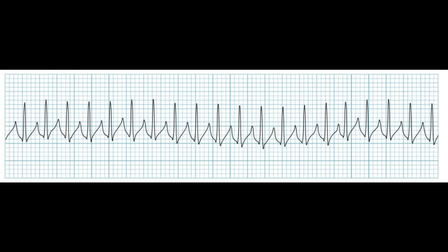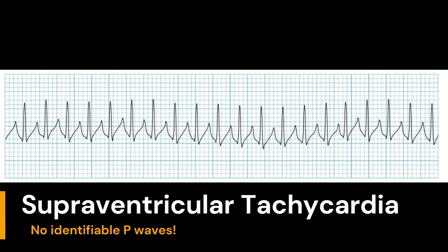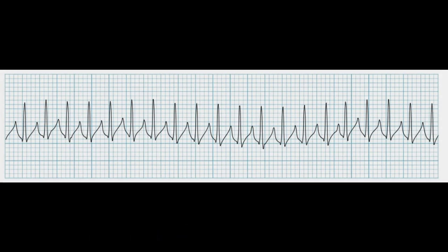Finally, it's worth noting that P waves can be difficult to see in certain situations, such as when the heart rate is very fast or when the EKG leads are improperly placed.